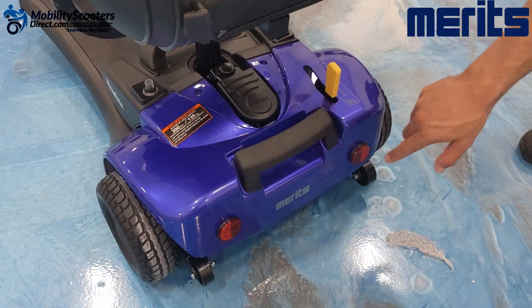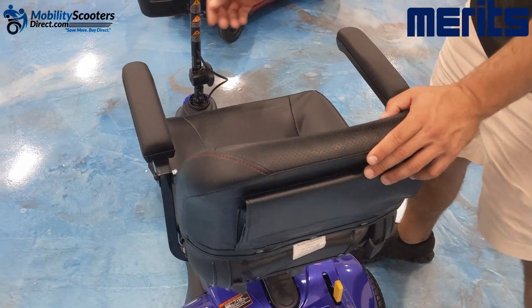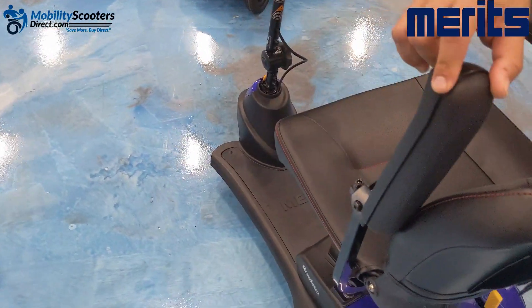In the rear, we have some anti-tip wheels, reflectors, and a pouch on the back of the seat. The seat comes with armrests — they are removable and they can flip up.